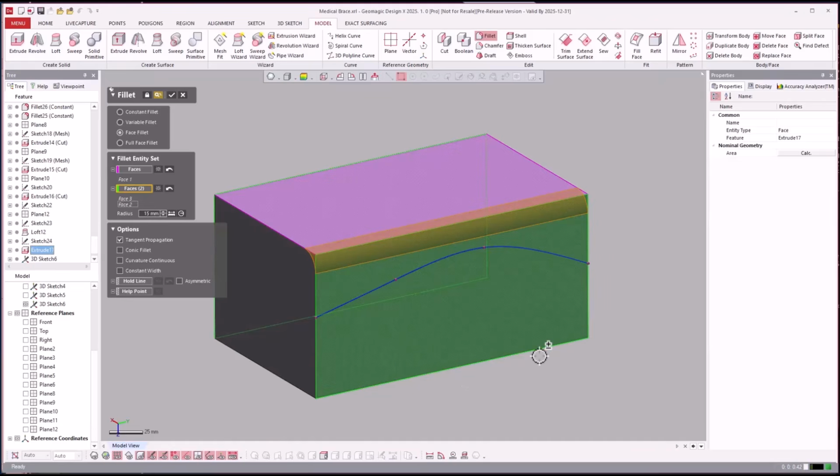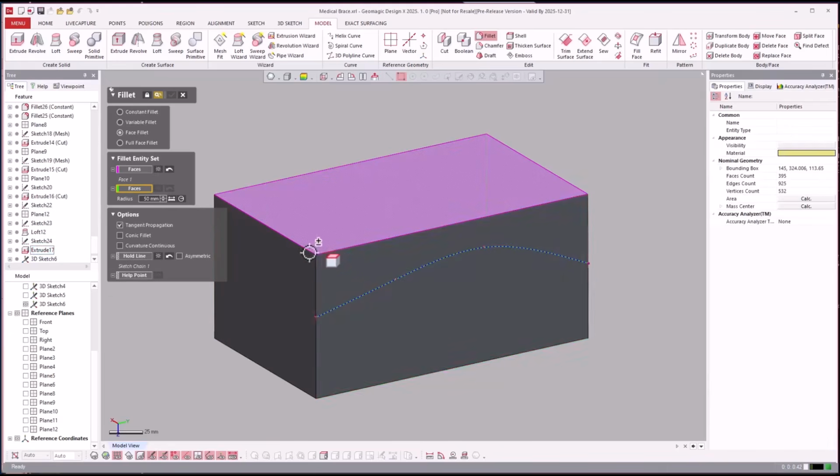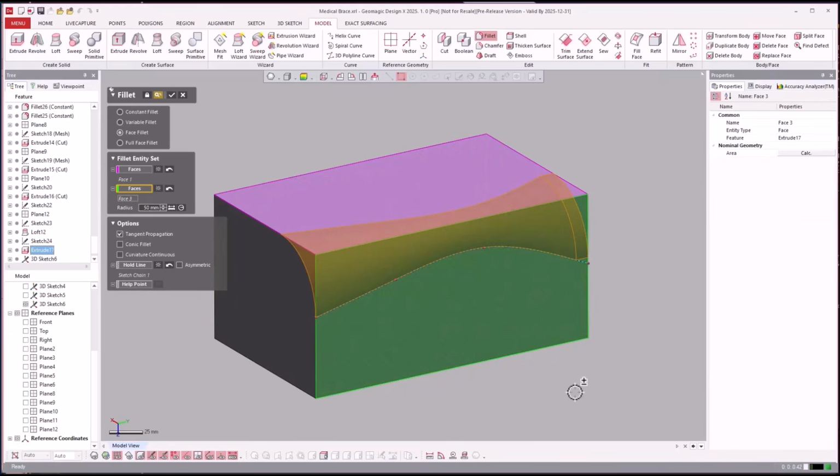And you see here, I got a 15. I have a 15 millimeter fillet going on. You can actually say hold line, and I can click that hold line, and then I can come over and click these again. What's going on here? And I can type this up to like 50. And I finally got it correct here. So the picking is just not treating me well today.